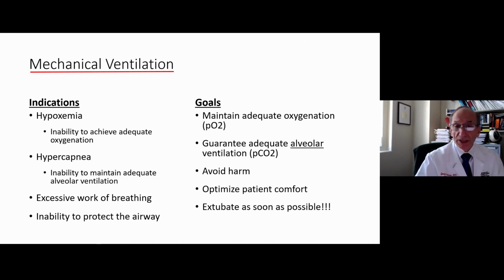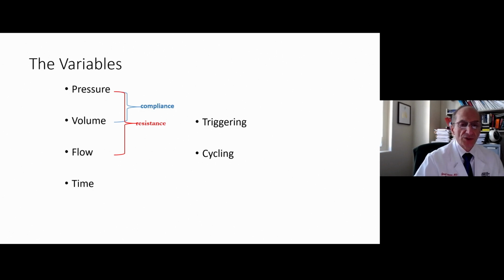We want to optimize comfort as compassionate caregivers, and because if we don't, then we have to medicate them, which is really not an optimal goal. And then also a guiding principle here is to extubate, or to remove mechanical support, as soon as is possible, also in the spirit of minimizing harm.